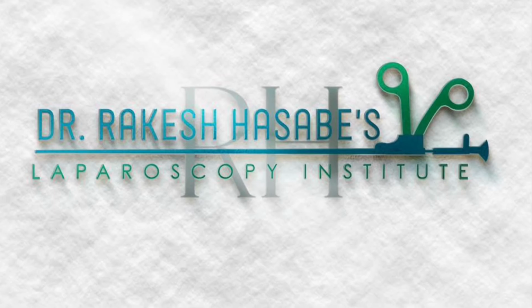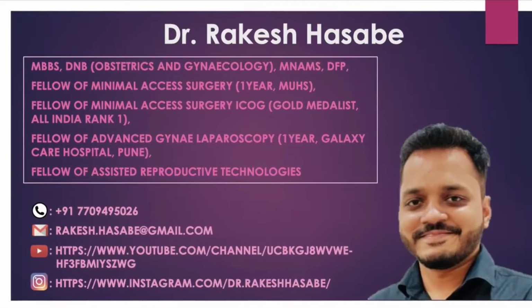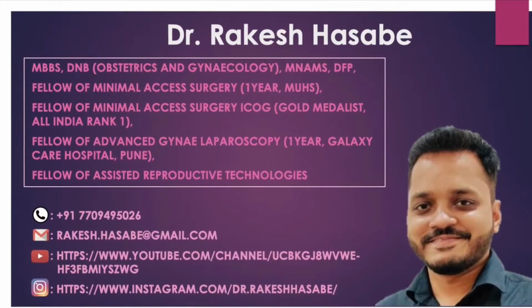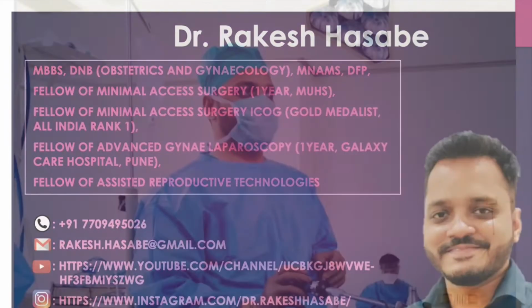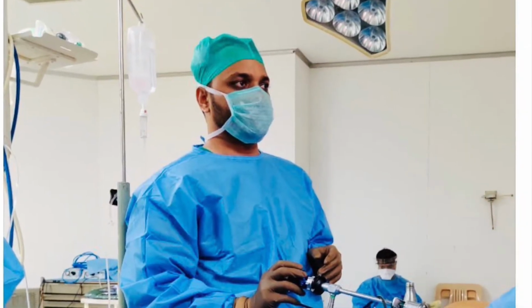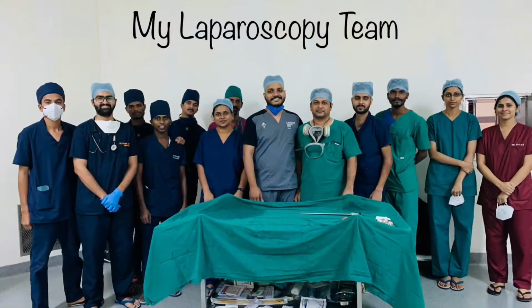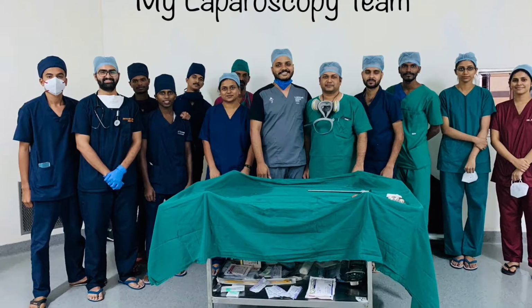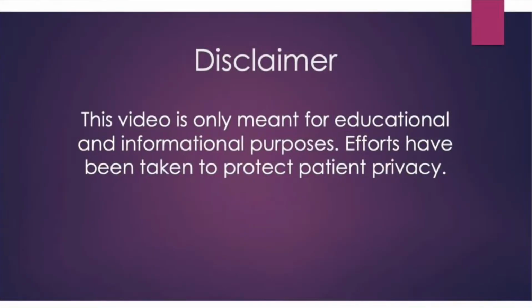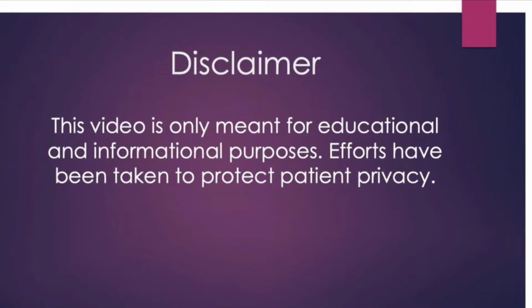So this 58-year-old female was diagnosed with cervical cancer, and on MRI pelvis, a mass was seen abutting the rectum posteriorly, and anteriorly the growth was abutting the posterior wall of the bladder. The report said that the fat planes between the mass and the bladder were lost, and hence to rule out direct bladder involvement, diagnostic cystoscopy was planned.